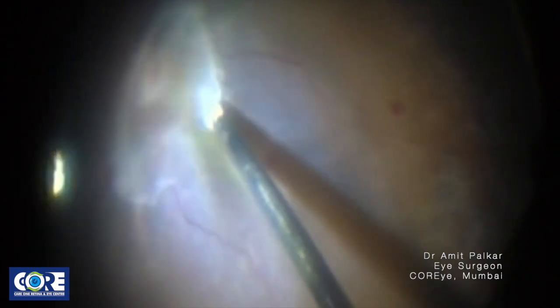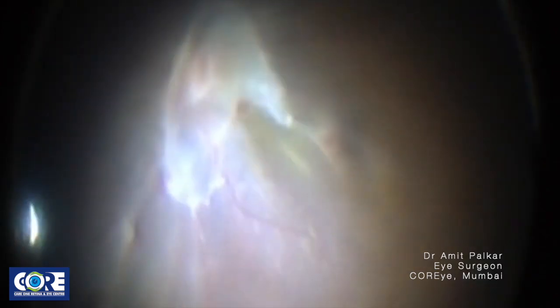Hi folks, today we are going to see tackling a diabetic membrane. This appears to be a very flat membrane. Forgive me for the blooming in the video.